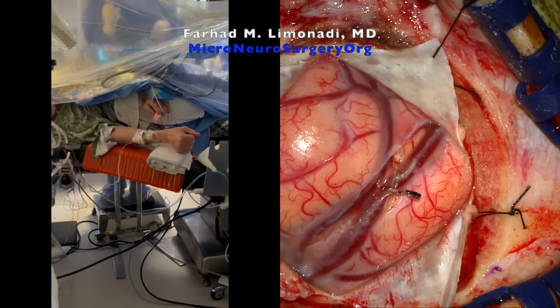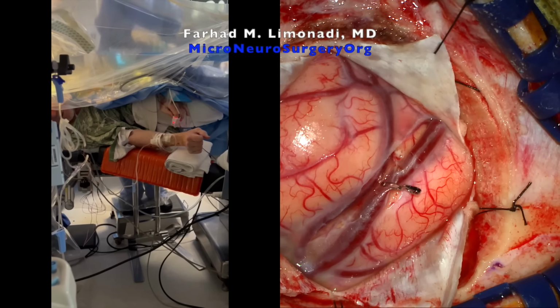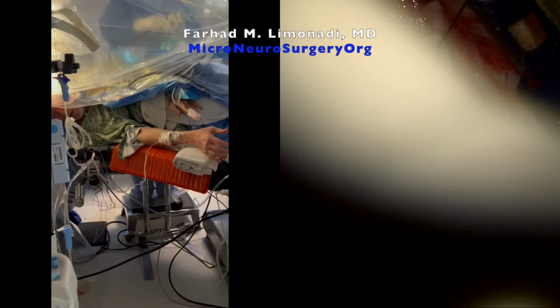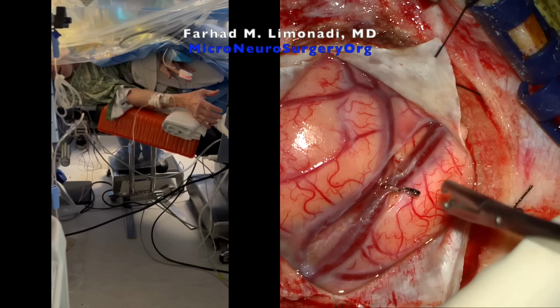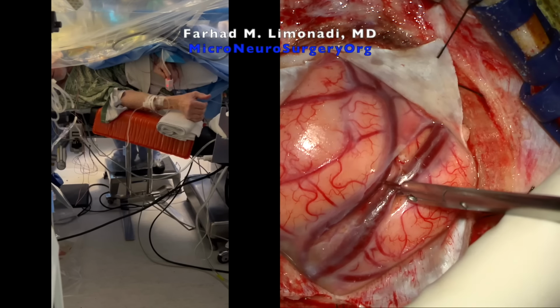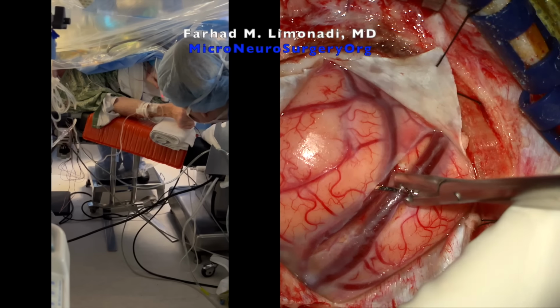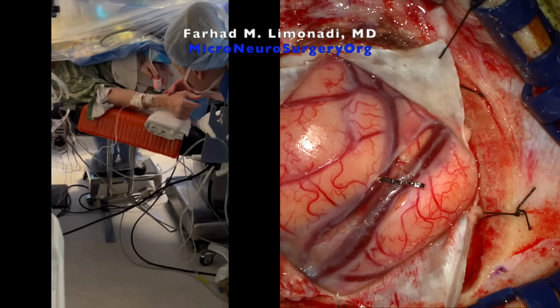You're doing awesome. I think that looks pretty good. I think that's okay. I'm still gonna keep it alive, just because. Now can I see your applicator again? I can't quite move the right arm as much as I'd like. It's moving, but not quite as much as I'd like. Looks like you're moving it pretty good. Okay. Keep irrigation.